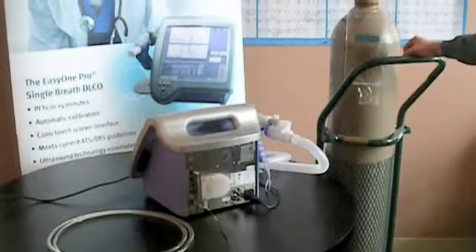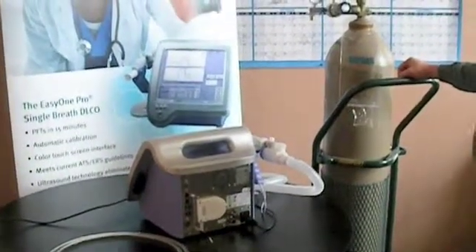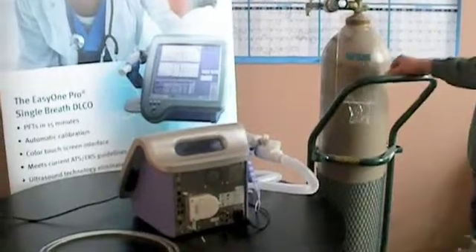This is our NDD Easy One Pro Pulmonary System. We're going to hook up the DLCO gas with a large bottle, an HK tank, using the appropriate regulator and tube provided.